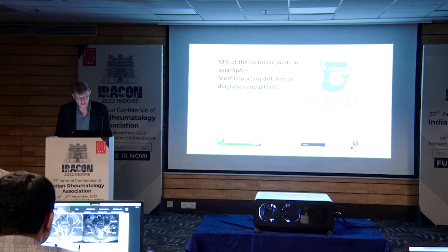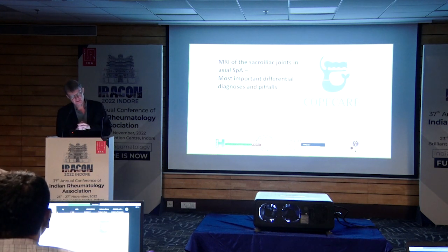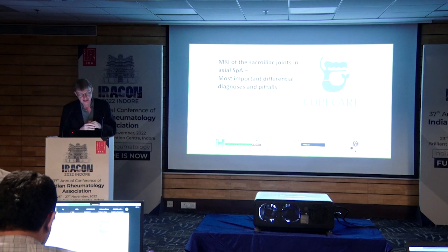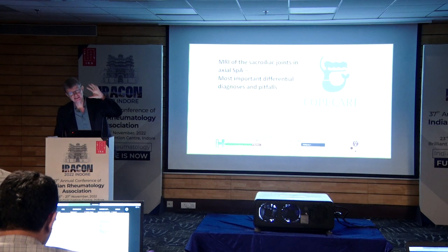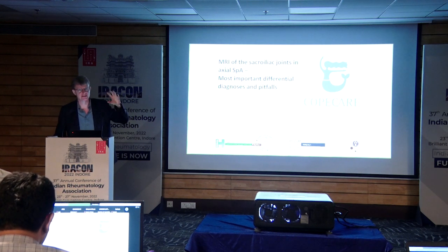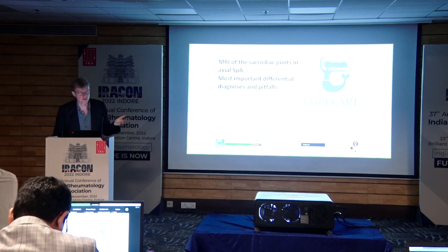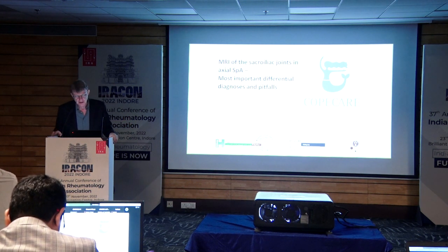Another slide I didn't show is a comparison with CT, which I can find if you want it. I can do that in the lunch break. But with CT as a gold standard, CT is really excellent for visualizing structural components like new bone and erosions. It's very accurate for that, but not good for inflammation. And it gives some radiation, therefore we don't use it.